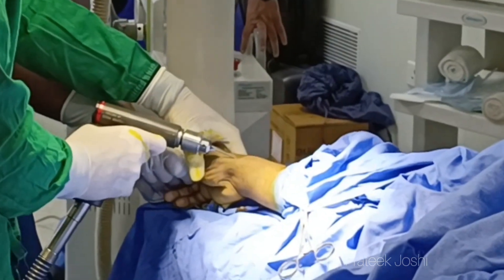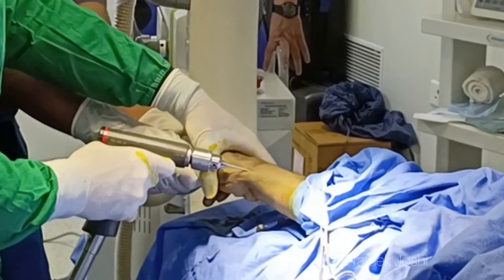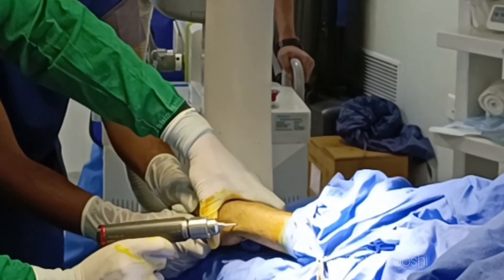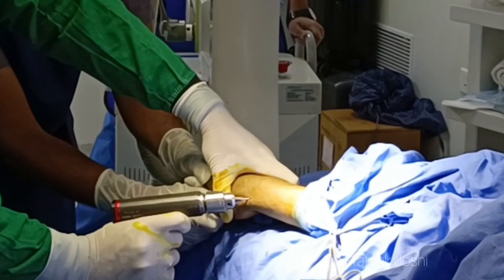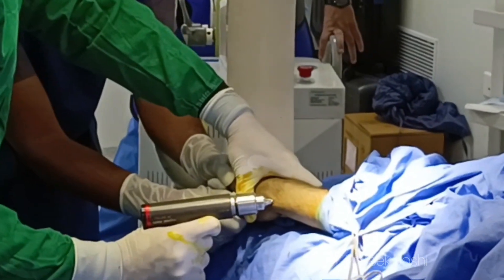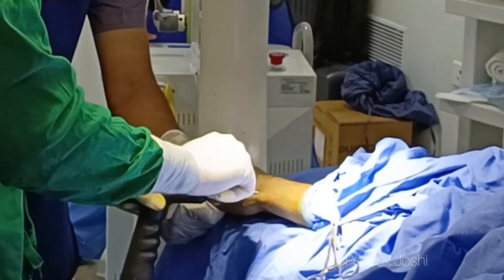Through the tip of the radial styloid process, I am also going to check the lateral view to make sure that the trajectory of my K-wire is correct. It is very important to be precise in drilling the K-wire, because multiple entries inside the bone will make this procedure useless — there won't be any hold of the wires in that scenario.